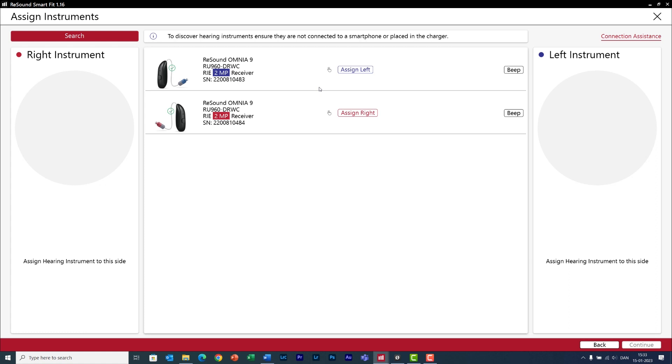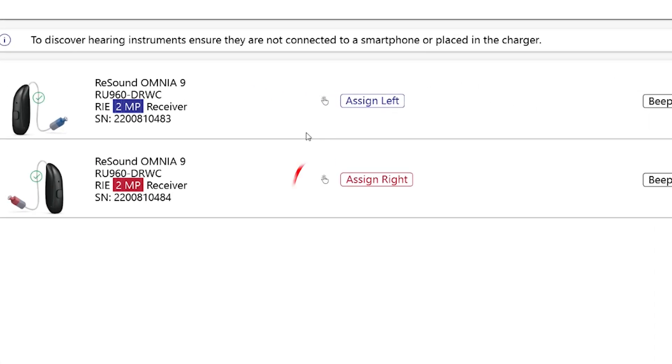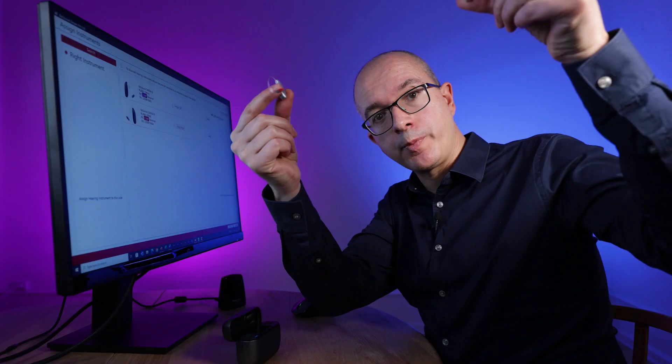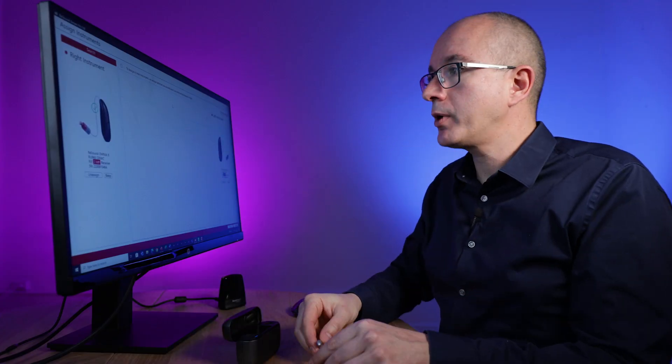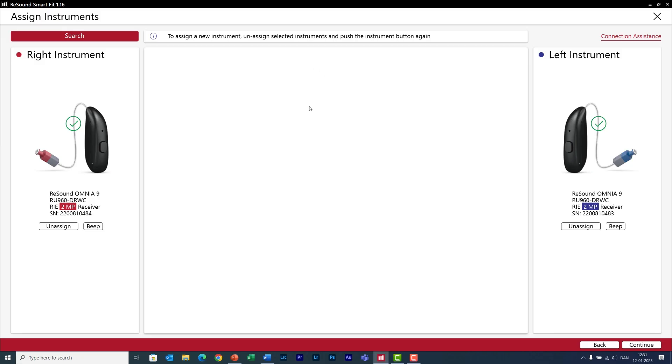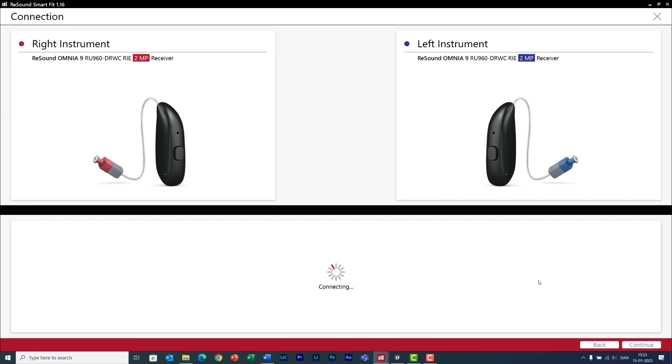But let me go back because I want to show you that if you see this hand icon here it means you can also connect very easily with the push button of the hearing aids, which is super fast. I click on the push button and now both hearing aids are connected. Now click on continue and both hearing aids will be programmed according to the audiological profile of your client.